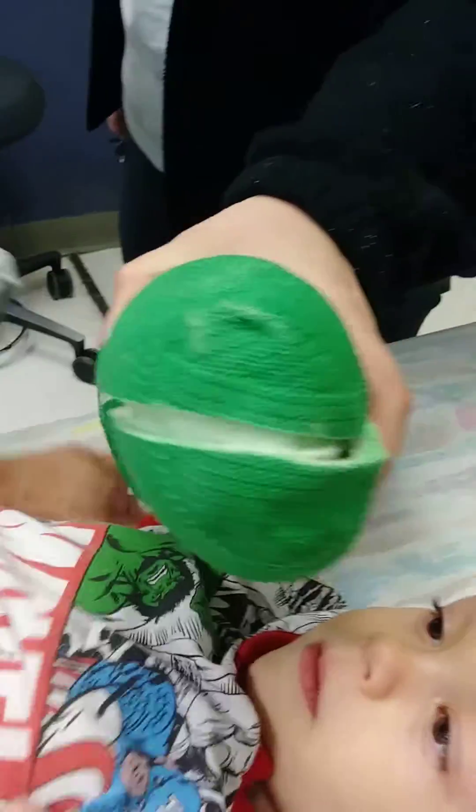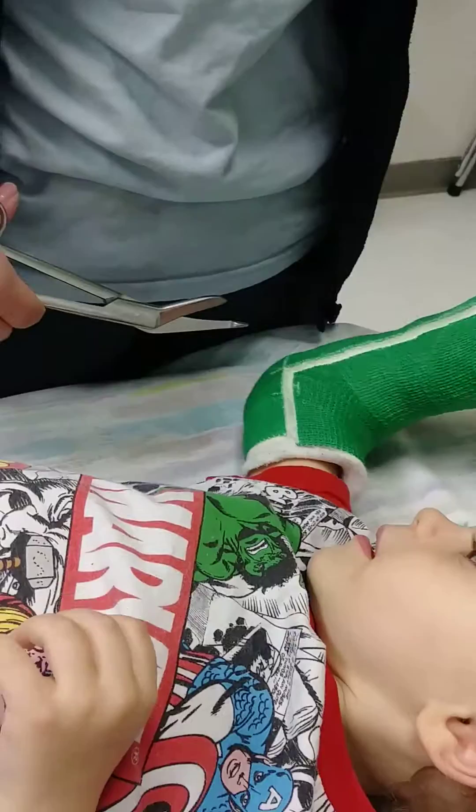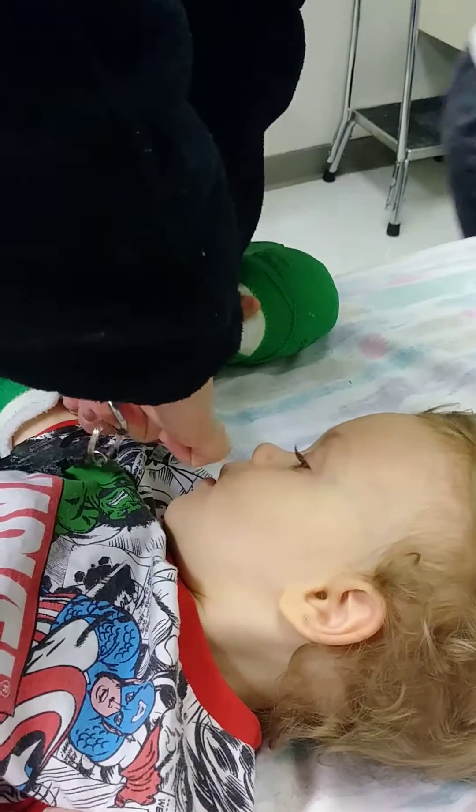We're just going to take the green part off and then there will be a dressing that Dr. Tyler will tape off once we find out what supplies she needs.